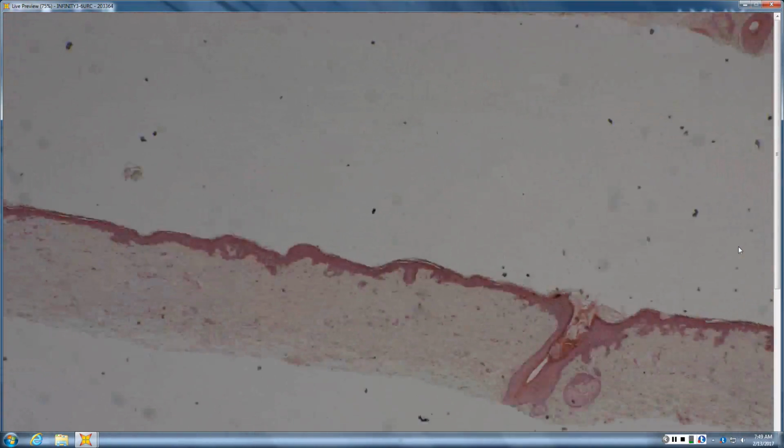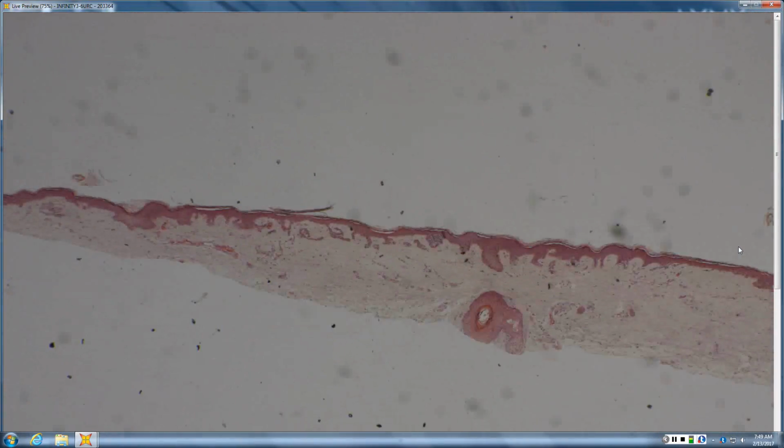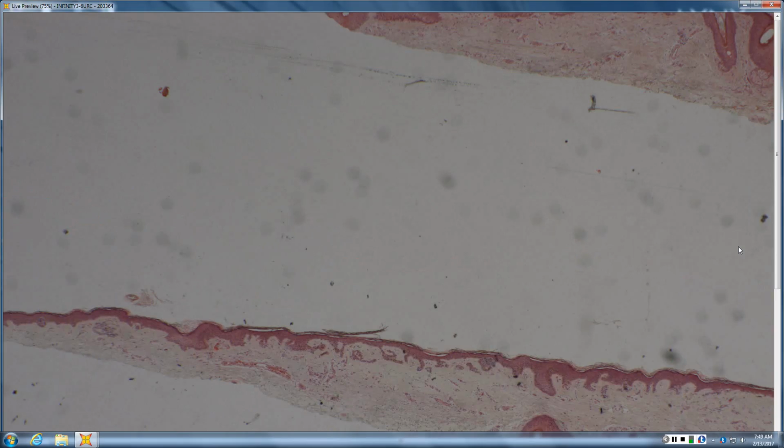Sheaves. And where do you think you are? My face. And how wide a specimen is this? This is a really wide specimen. What would compel you as a dermatologist to take this big a swipe of someone's face? My concern is lentigo maligna. You are correct. So big, broad shaves.